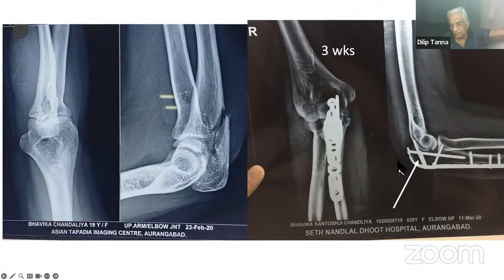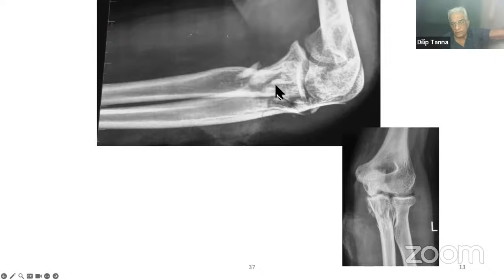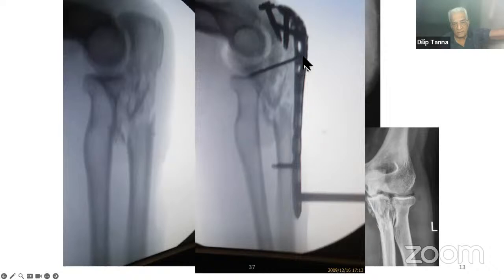Now for such a badly comminuted fracture, all you need first is this screw. Reconstruct the olecranon fossa. Then all these other screws will come, and you will be able to fix even such a comminuted fracture. This is the coronoid lag screw, the most important screw, and the lag screw. So you reconstructed the elbow joint.